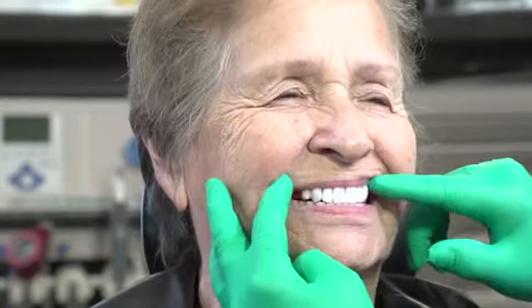Place the occlusal rim back in the mouth with the dental shells to evaluate midline, high lip line, low lip line, labial lingual position, and facial harmony. Make sure that the canines are appropriately positioned to look natural in the mouth. Allow your patient to inspect and approve.